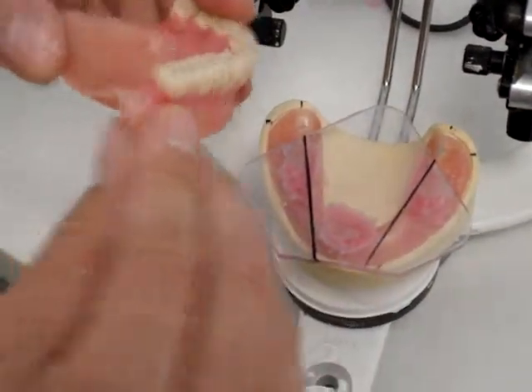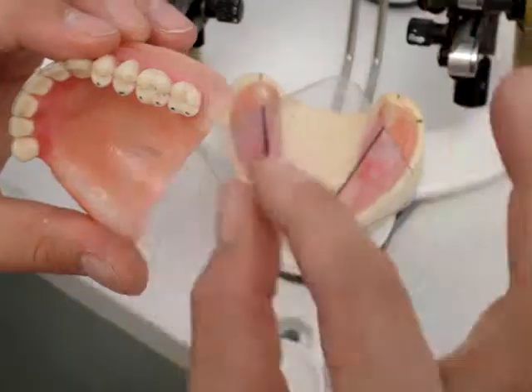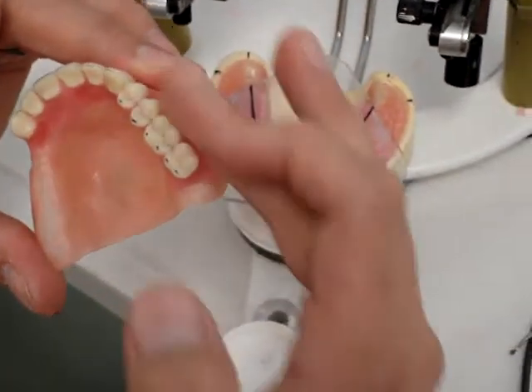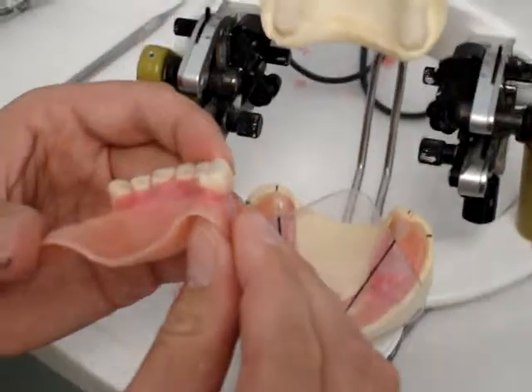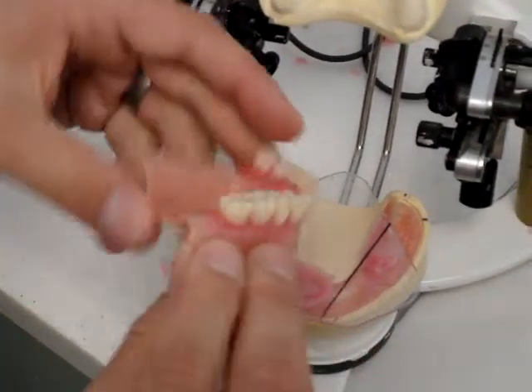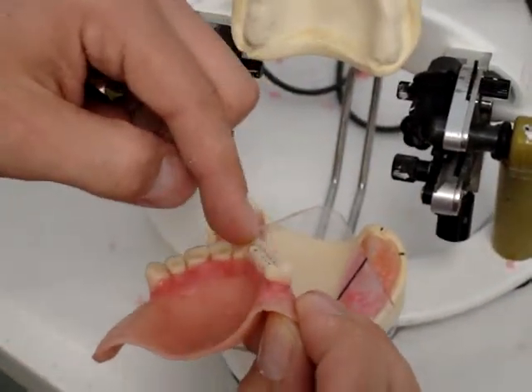You might have some, just because of the shape of the teeth. See, these aren't perfectly straight, they're kind of tapered. You might see some natural curvature here on the buccal side, which is normal. That's just the way the teeth are. But the important part is getting the central groove straight and these cusp tips lined up.